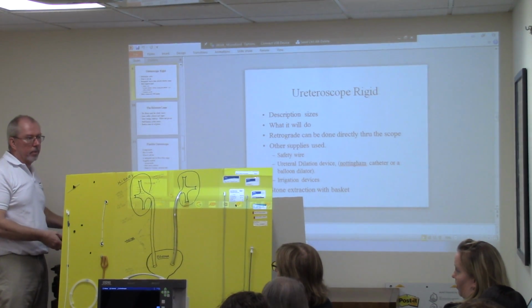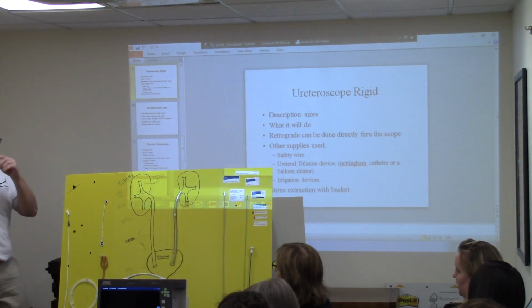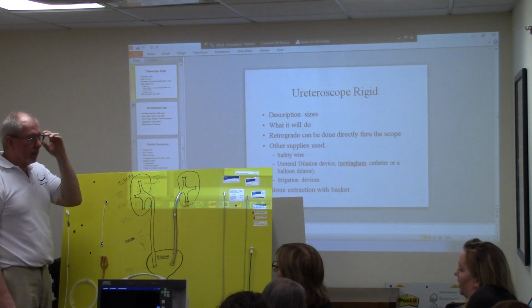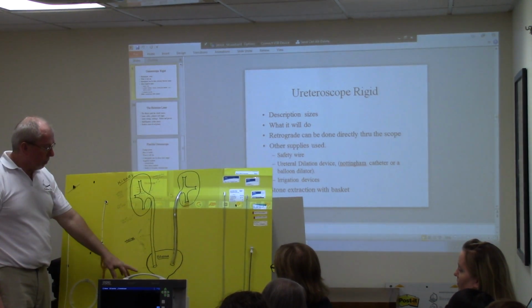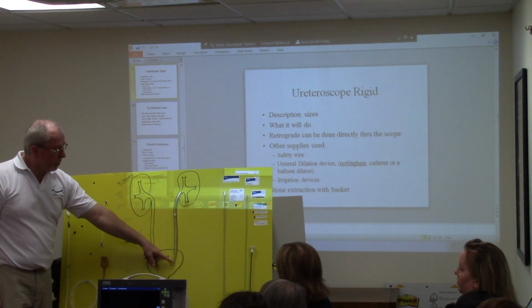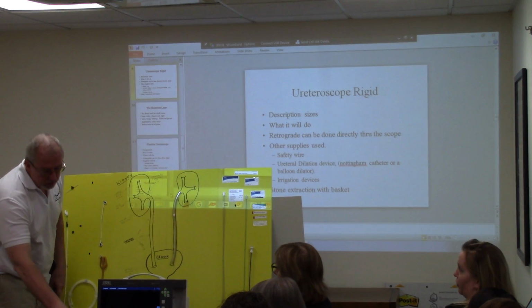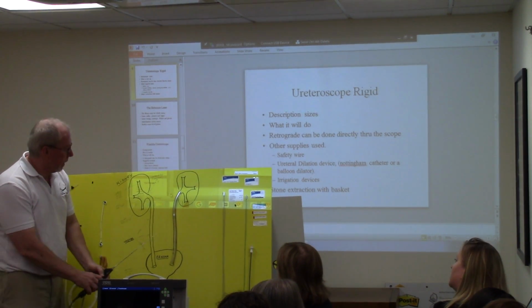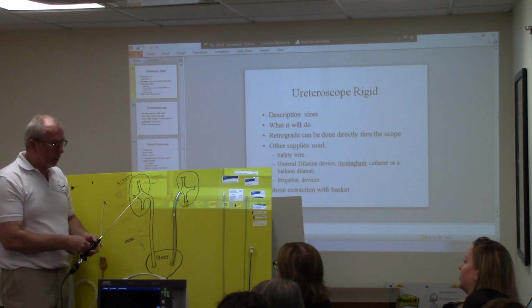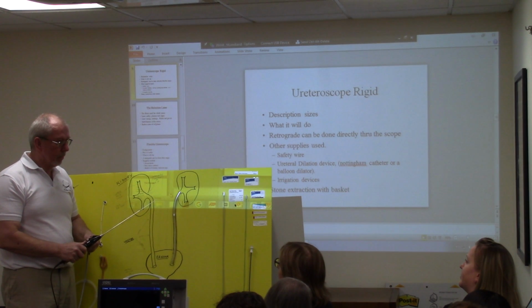I've got a question on the IVP, do you inject it through that? Or how do you inject the IVP? Would it be through either scope? It could be, yeah. So IVP is like a dye, right? Another form of a dye? Right. So if you're not going up the ureter with a ureteroscope, then you just put the catheter in and inject the dye. Can they do it through the ureteroscope too? Yeah, as long as this is already in the ureter, then you're ready to go, you can just inject it through one of these ports. Why do they do IVP and other, or different types of contrast, I guess, or different dyes?